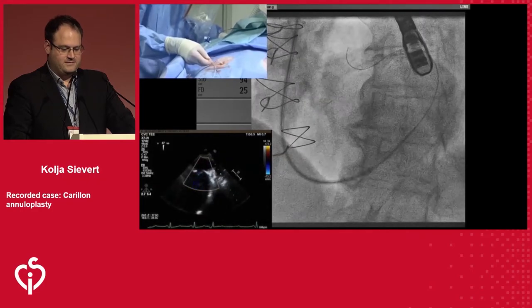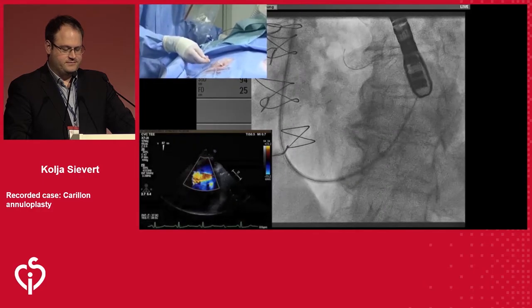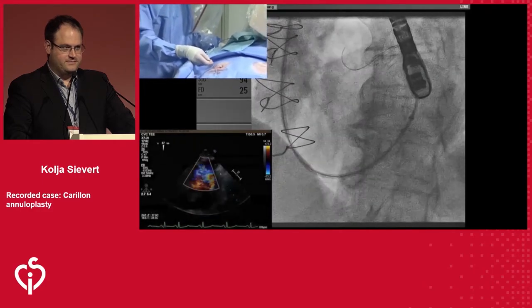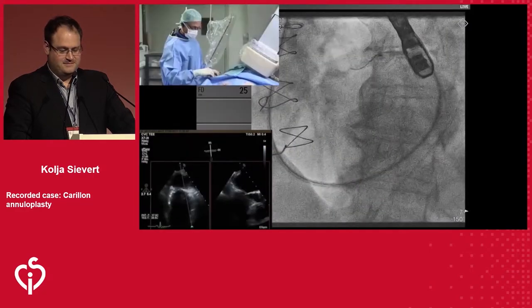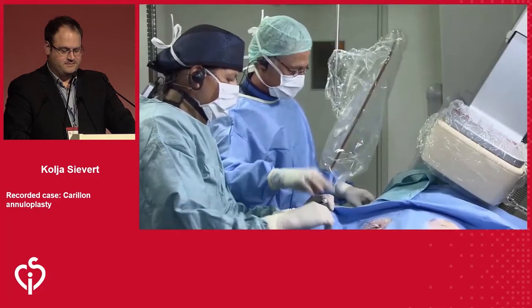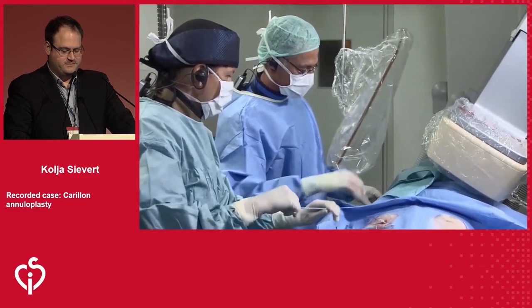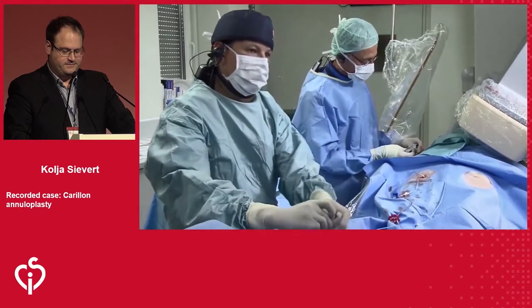Sometimes this part is difficult, but it's very easy because it's a live case, so that's why it's so easy. It's okay. So I'm just advancing here more and more. So now, again, this is the way interventionalists do this. Now let's do a diagnostic angiogram, and then Evan will be ready to do some measurements and decide.